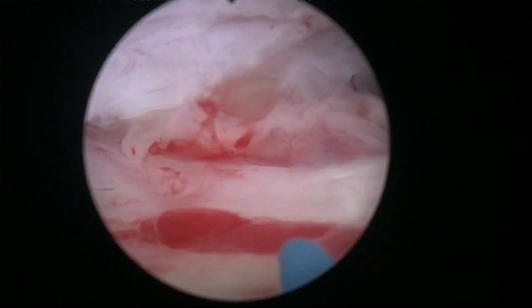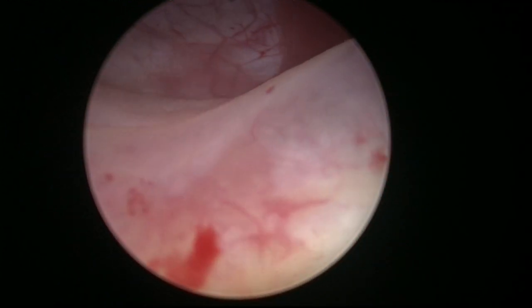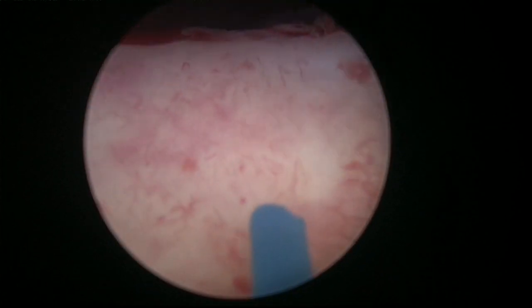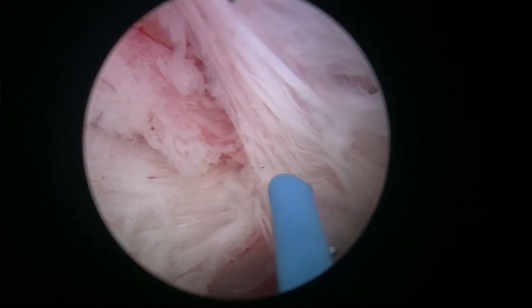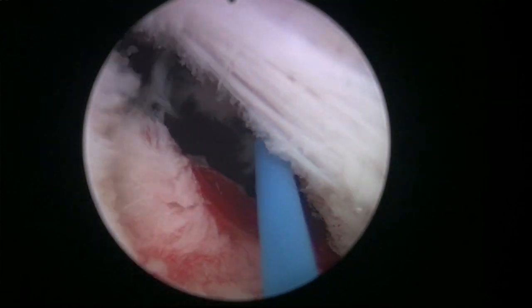Here's the bladder neck. The wall must be near here somewhere. There it is. It's safe, but close. And this is the last attachment here, you see. Sometimes it's difficult to get there from below. So if you tilt the adenoma into the bladder, it becomes much easier to target it and cut it.